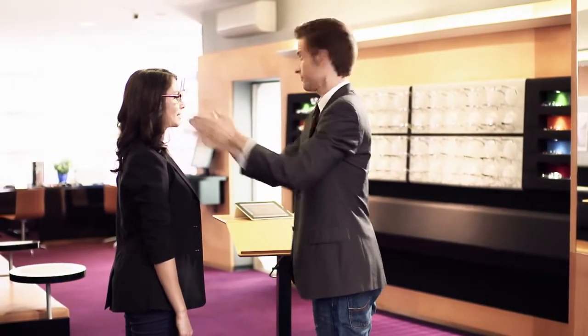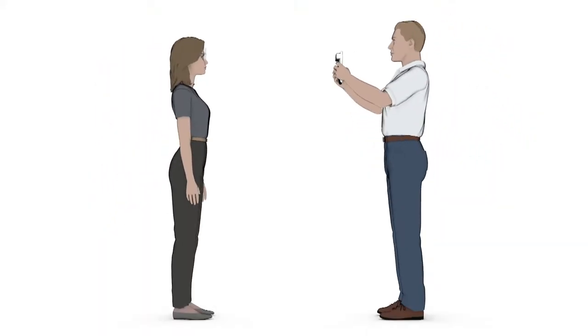Take your Visoreal portable and stand in front of your patient. The optimal distance between optics and patient is 1 meter.